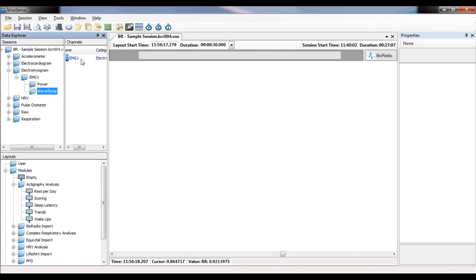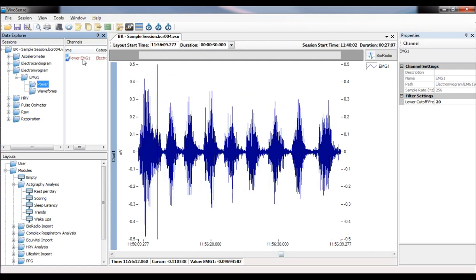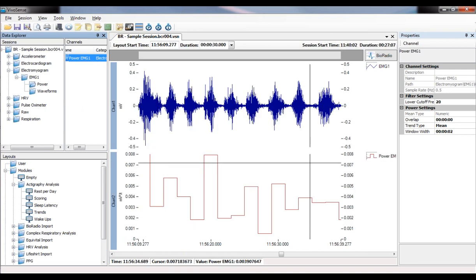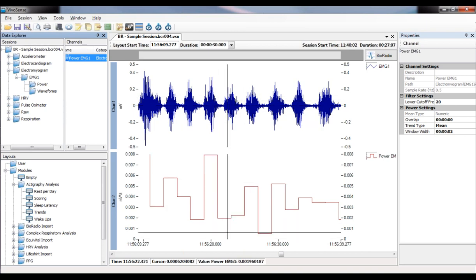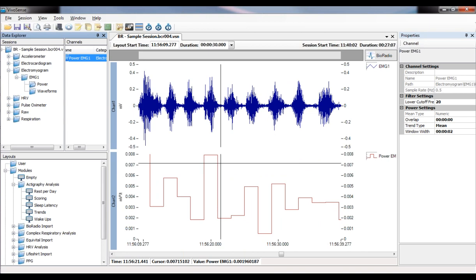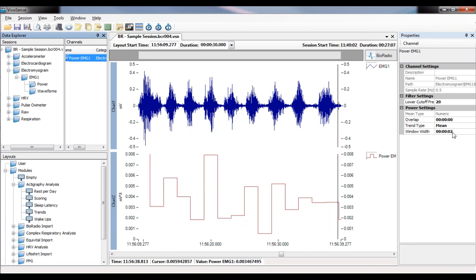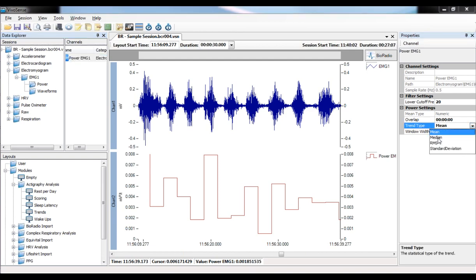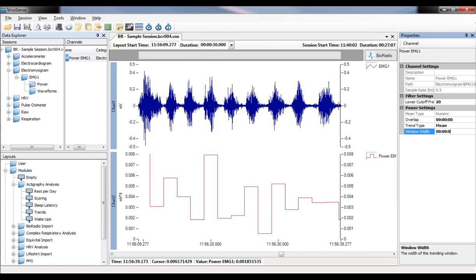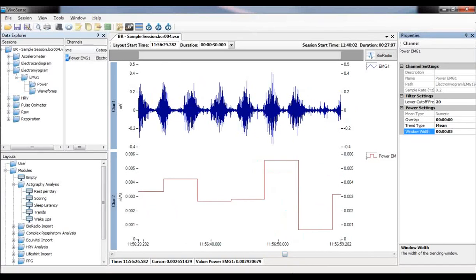For EMG in VivoSense, you can view a 30-second window and perform several different calculations. Double-clicking shows the power of the EMG signal, giving you an easier way to compare different points of activation or compare intensities of muscle firing. What you're looking at is a mean calculation of the EMG signal over two-second windows. You can also calculate median, standard deviation, or RMS processing, and by changing the window size, it will average power calculations over different sizes appropriate for your study.